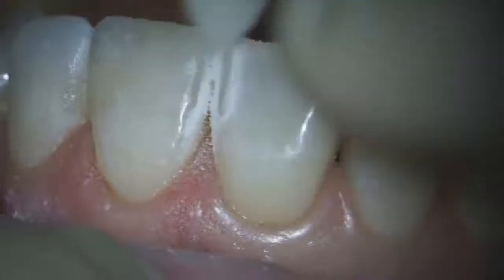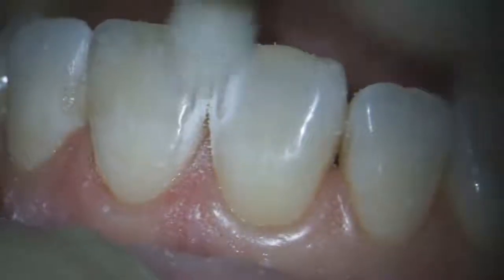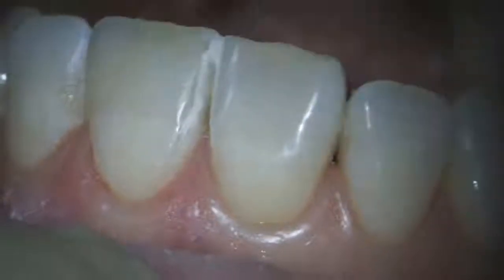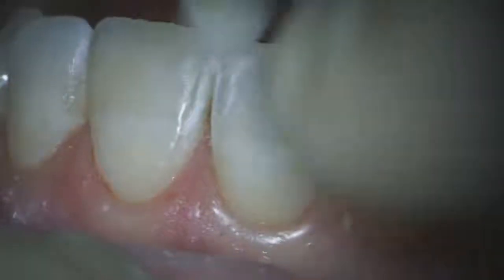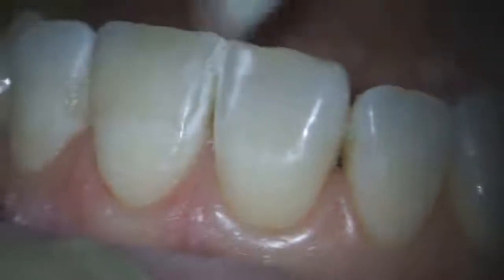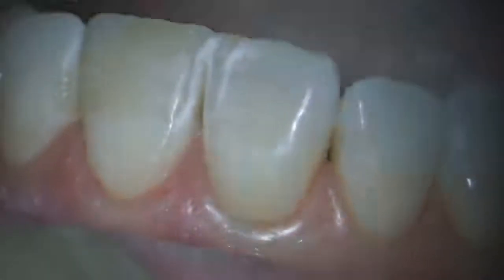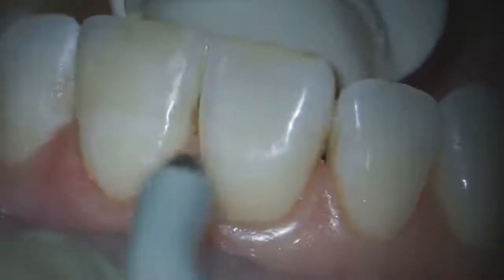And if you're working through the microscope, I advise you to take it away sometimes and look at the teeth without magnification. When we are looking at the teeth through the microscope, our volume perception gets worse. That's why it's better to look sometimes at the tooth surface without magnification.